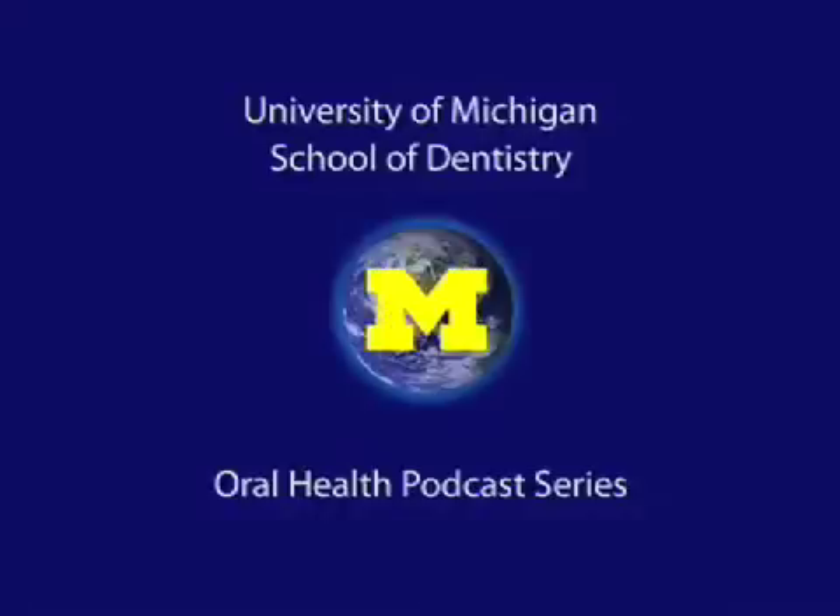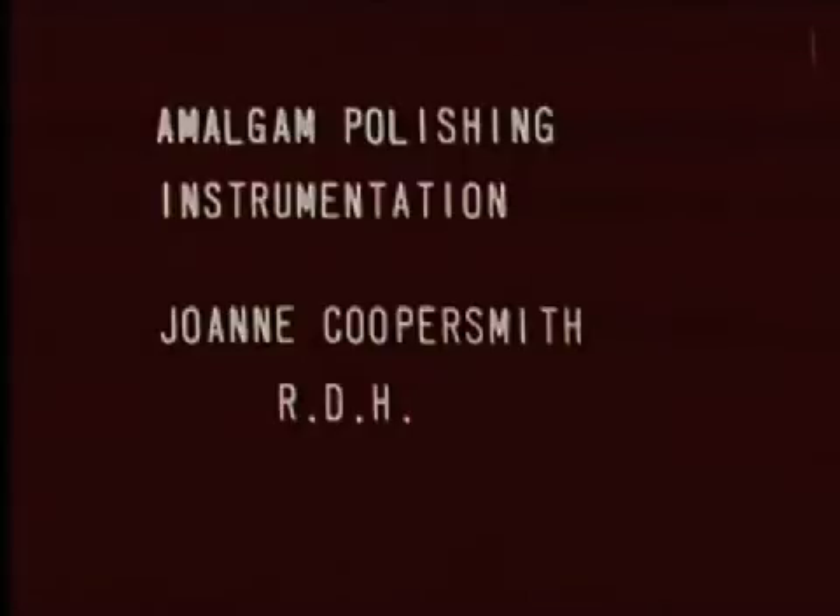Welcome to the University of Michigan Dentistry Podcast Series, promoting oral health care worldwide. The purpose of this presentation will be to take a closer look at some of the instruments you will be using in your amalgam polishing procedures. Since you're already acquainted with most of the equipment used during polishing, we're not going to go over that today. To begin with, I'd like to acquaint you with the instruments you will first use in polishing class 2 restorations.